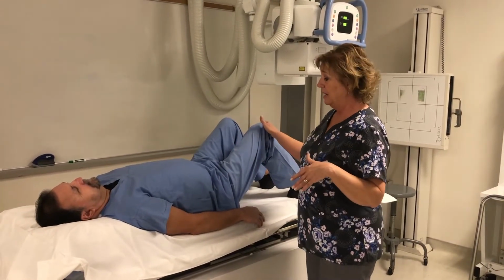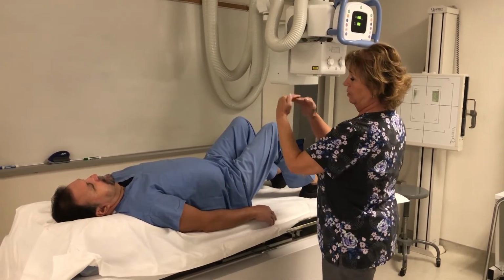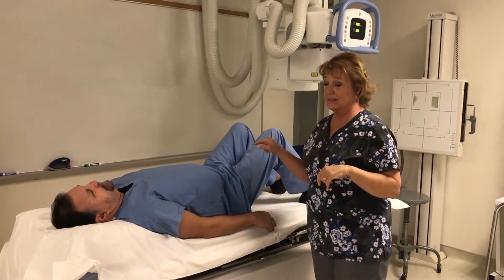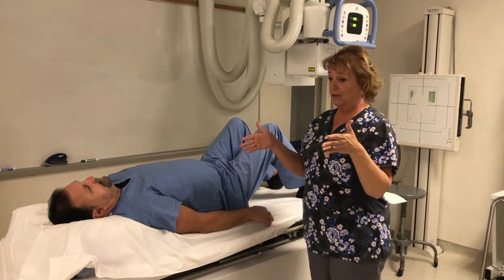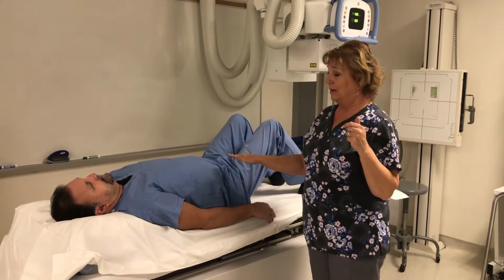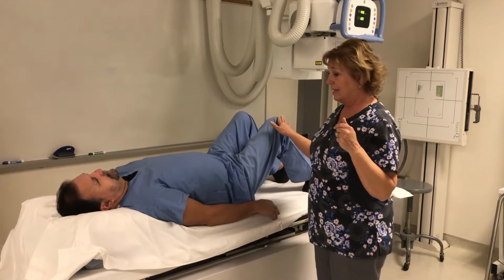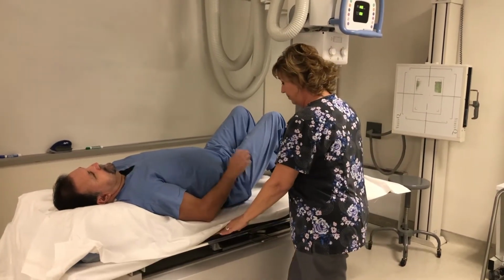So just by flexing the hips and knees, you take the normal lordotic curve and flatten it out. It's also best to then see the disc spaces between the lumbar vertebrae. So we do it for 2 reasons. Radiographically, it's better for imaging, and for patient comfort, flexing the hips and knees reduces the pain and strain on the back.